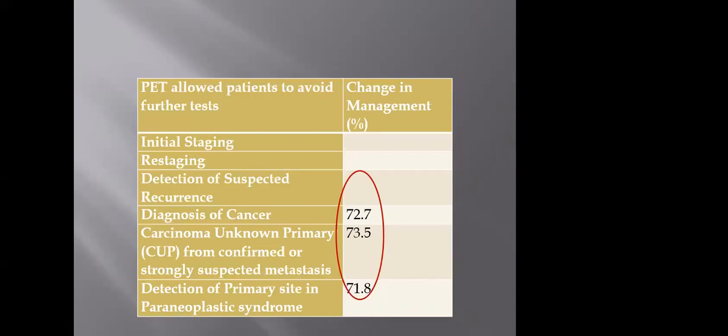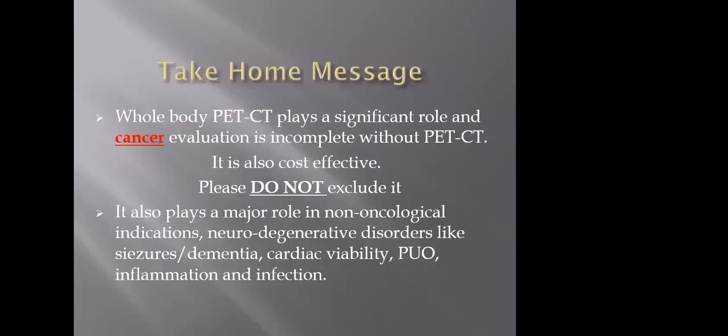This slide shows you that after the PET was done, there was no need for any further evaluation, especially in diagnosing a cancer or in unknown primaries, or even in detection of paraneoplastic syndrome. You can see that 70% of the patients just did not need any further evaluation.